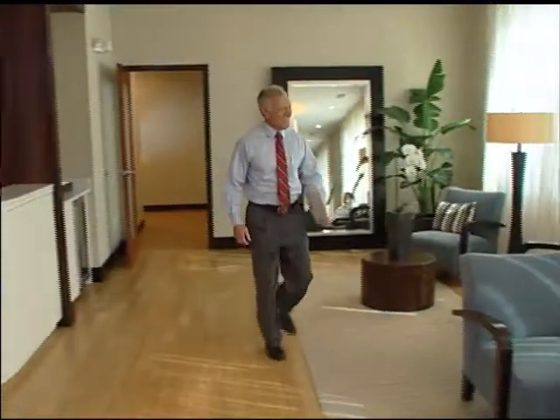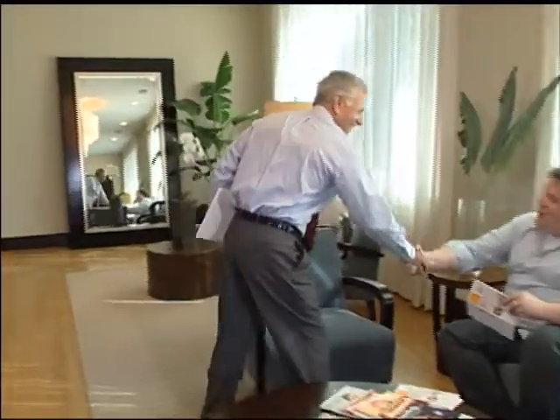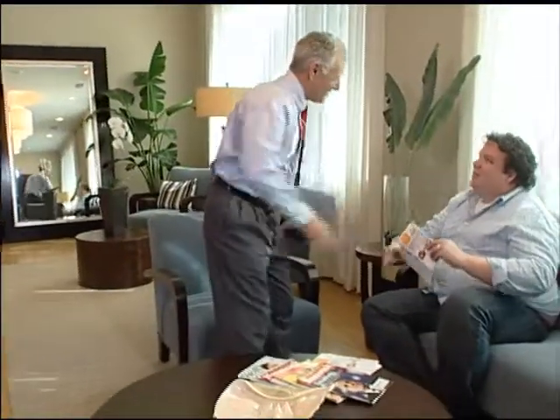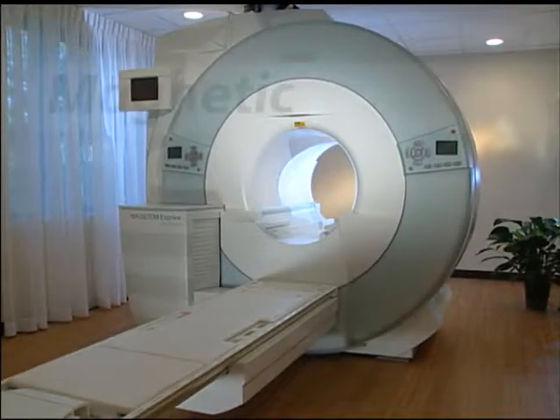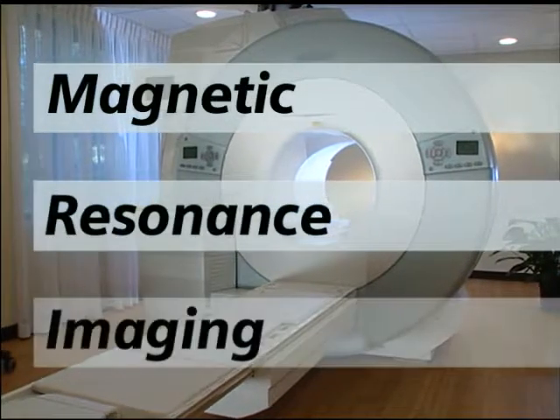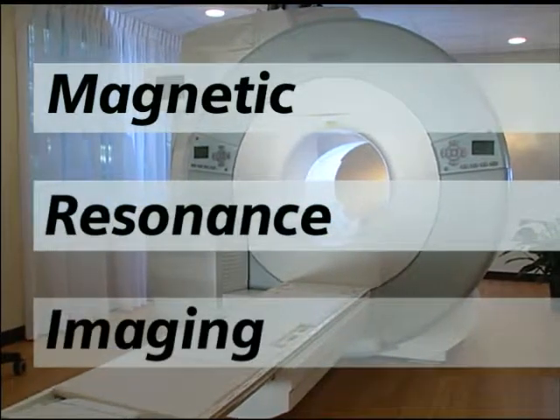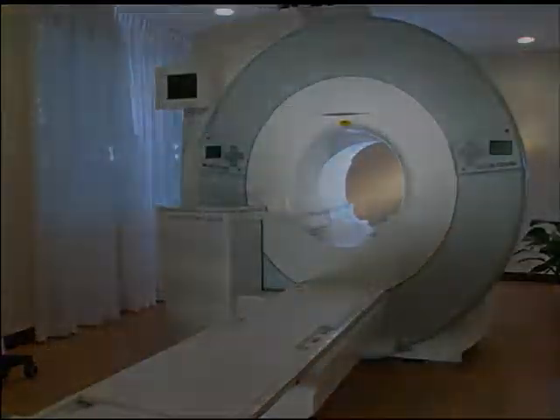Welcome to this MRI patient education video. Your physician has ordered an MRI for your medical condition. MRI stands for Magnetic Resonance Imaging, and for the next few minutes, we'll discuss the MRI examination.